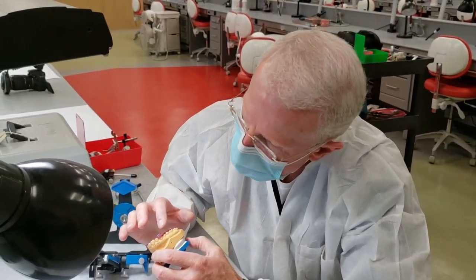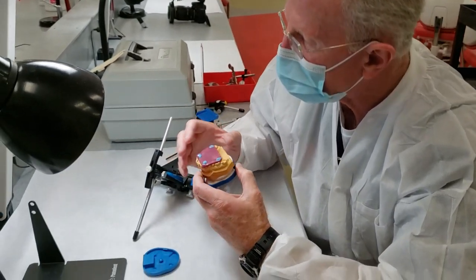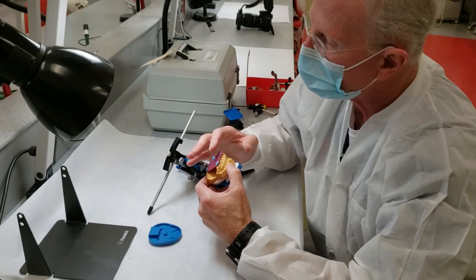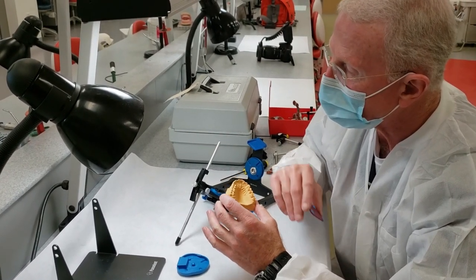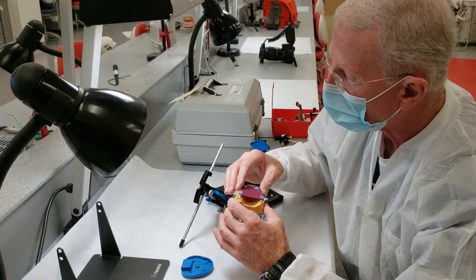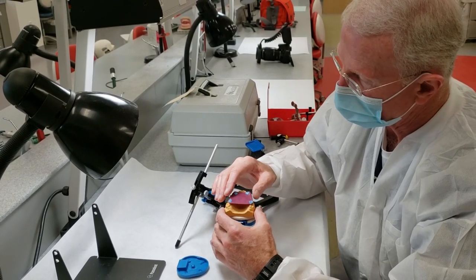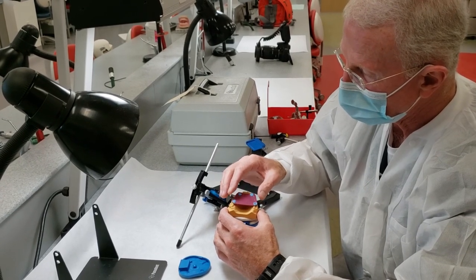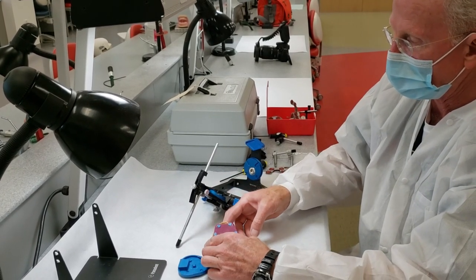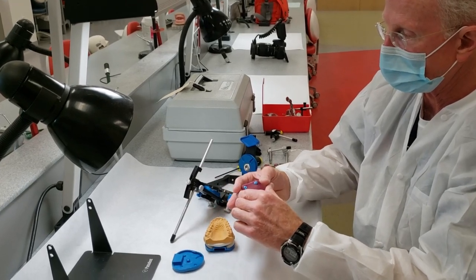It seems to set down nicely. Look around the edges to make sure there are no gaps — if there are, you may have left a bleb somewhere on your occlusal surface, or this bite record may have warped a little. But this one seems very secure on the upper arch. We're going to try the same thing on the lower arch.